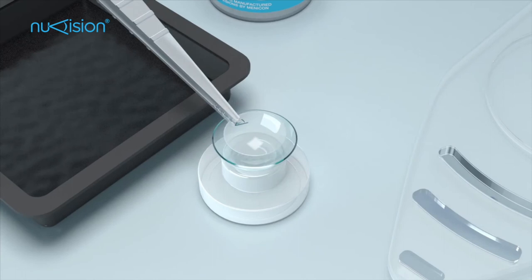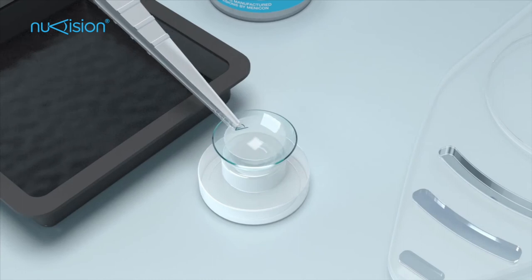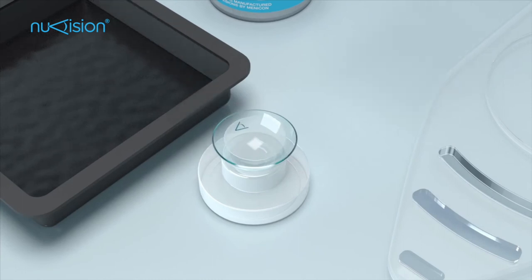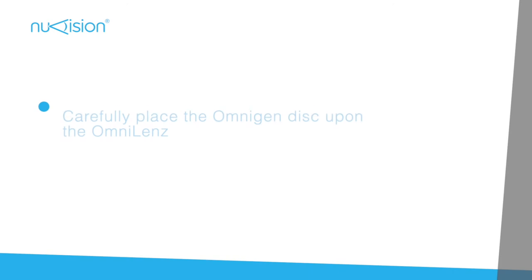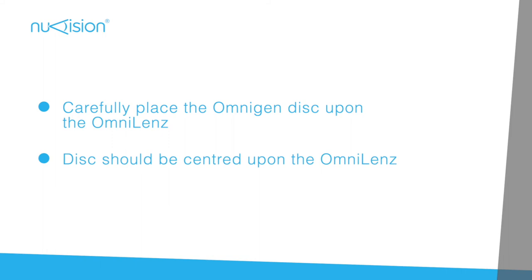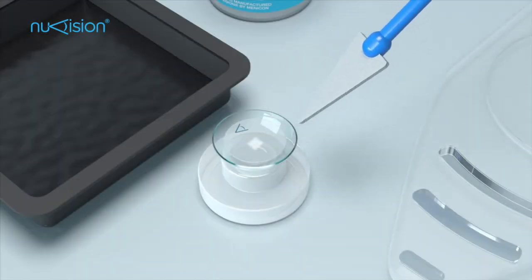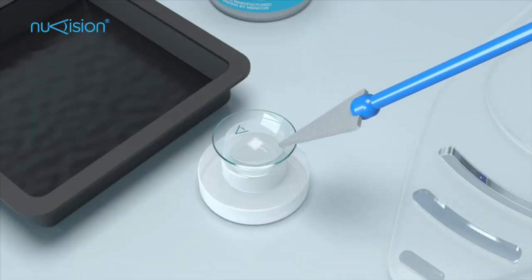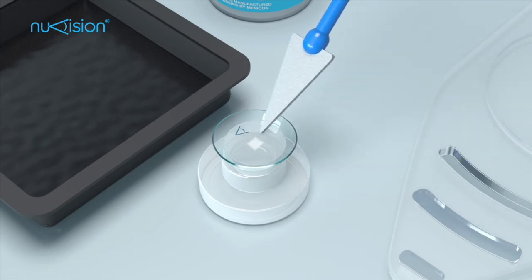Carefully insert the Omnigen into the centre of the OmniLens. Slowly allow the Omnigen disc to make contact with the lens, starting at one edge before gently releasing the forceps from the tissue. Now allow the Omnigen disc to rehydrate in the OmniLens for 2 minutes. If the Omnigen is not centred in the lens or is creased, use a surgical spear or forceps to carefully adjust the position and smooth out the disc.